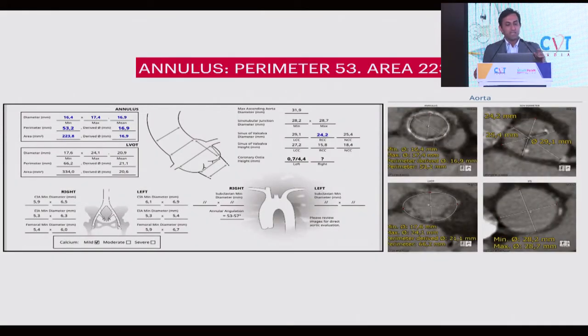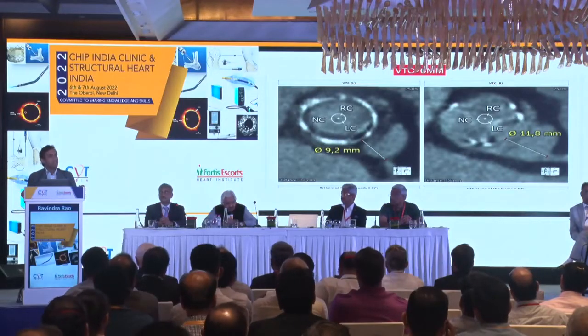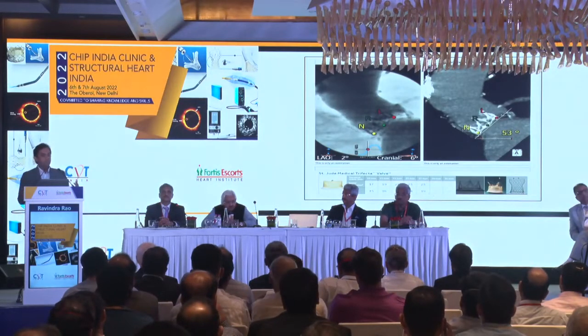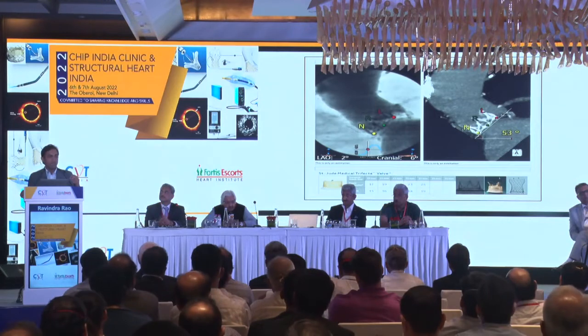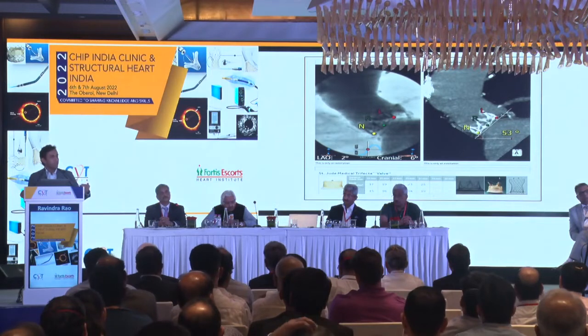So look at the CT scan. The perimeter is 53, area is 223. The only valve which can be used in this situation is a supra-annular self-expanding valve. But the important thing which I want to highlight here is the VTC again. So you see coronaries are low, but the VTC is 9.2 mm, more than 6 millimeter. So there's very low chance of coronary occlusion in this patient. So this is a standard Trifecta valve. Why this CT scan slide is important: you can see how the valve is sutured at the level of the annulus. Sometimes the valve can be obliquely placed and can be towards the left main. But here you can see the valve is away from the left main.